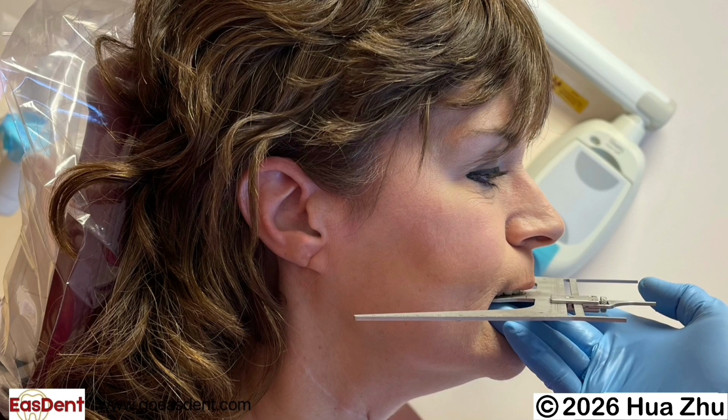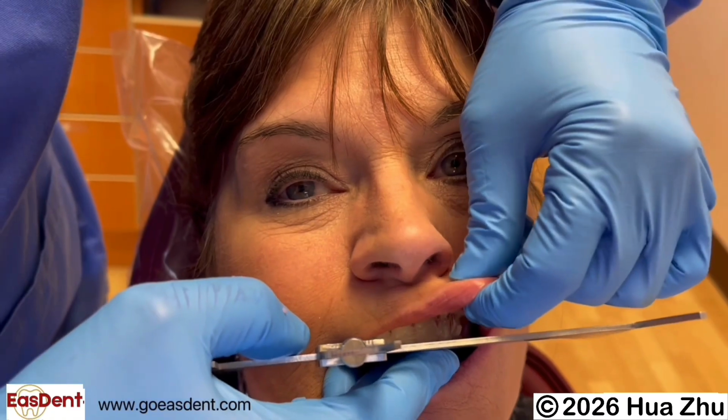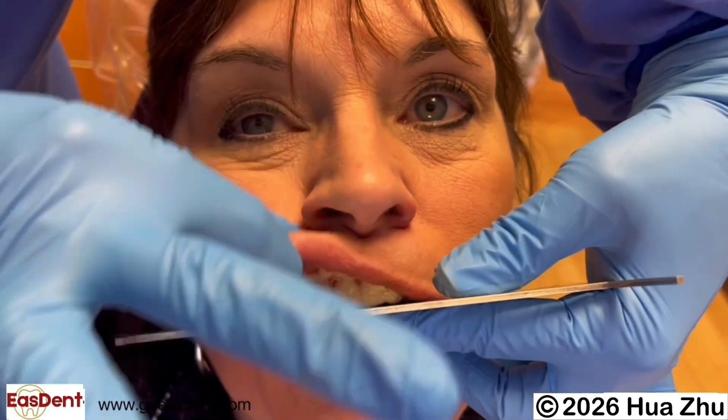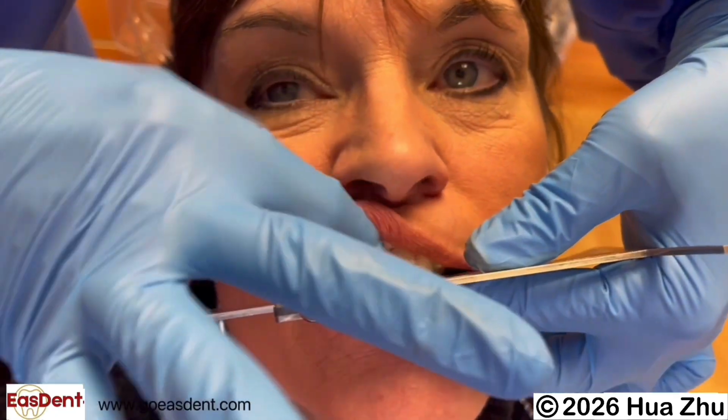Align the incisors at the correct sagittal position to provide appropriate lip support, buccolingually at rest, and good aesthetic result with smile. Make occlusal plane parallel to ala tragus line. If you have extra material at the border, pull the lip down with your fingers to push the extra material out and remove it.